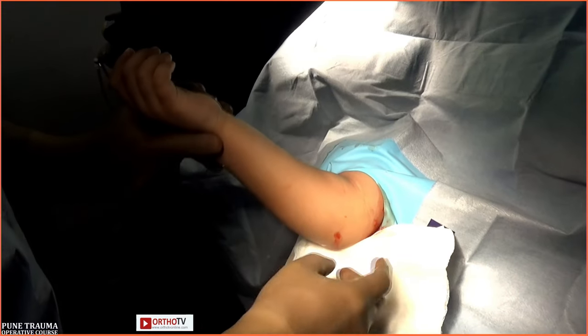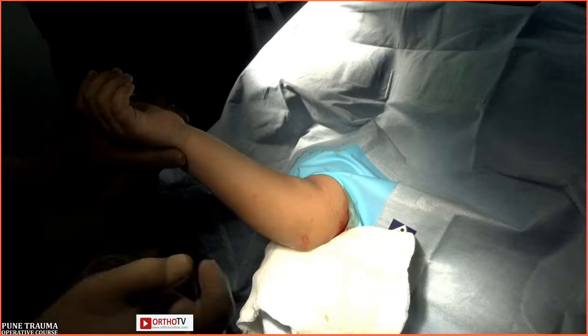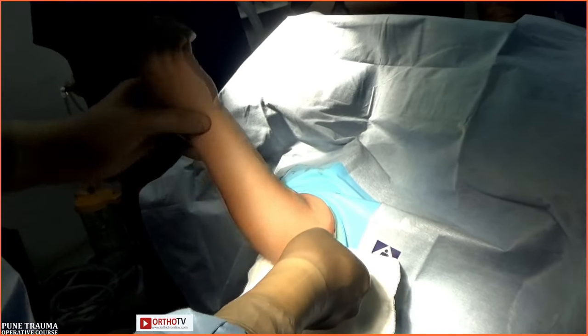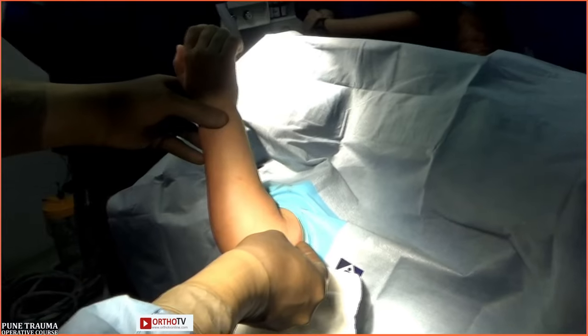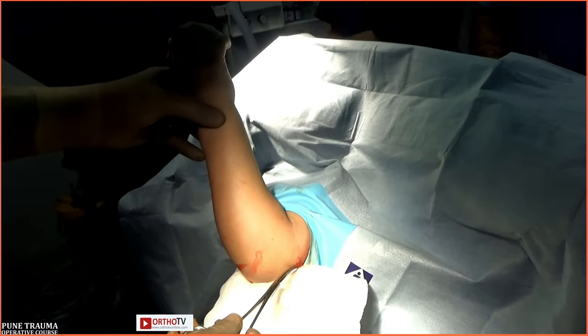And do you have a skin marking pen? Can you show where the ulnar nerve would be? Marking pen and... What would be your entry point? Yeah, so the ulnar nerve is here. Okay. Right. When I flex it, the ulnar nerve comes in my way. After I have the lateral pin here, the ulnar nerve is here.